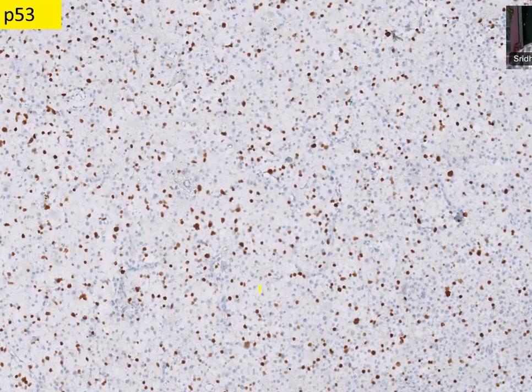What is this marker? Anita, what is this marker? P53, TP53. What does it stain? How does it stain? Is it cytoplasmic or nuclear? Nuclear. So, is this a normal protein or abnormal protein? IDH1 R132H, you saw the IHC. Is it a normal protein or abnormal protein?